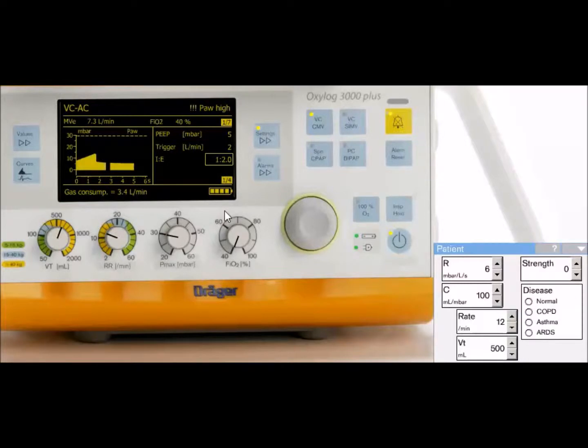To see this, let's make my patient spontaneously breathe. Right now we have a fixed flow rate, and if I look at my I:E ratio, it's approximately 22 liters per minute. I have a fixed tidal volume and a fixed respiratory rate, so I'm going to have a fixed I time based on this I:E ratio. So I have an inspiratory time of 1.7 seconds. I'm going to now have my patient breathe.